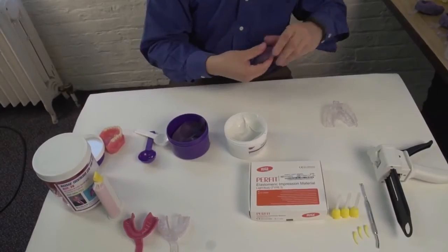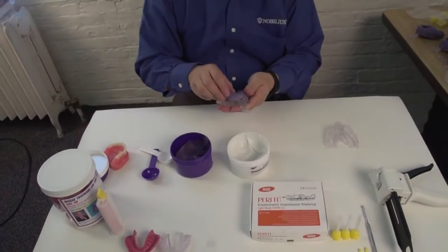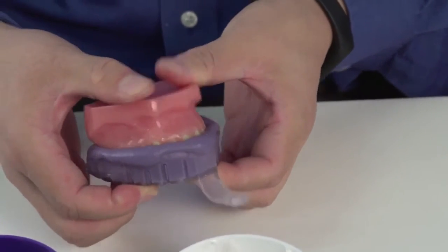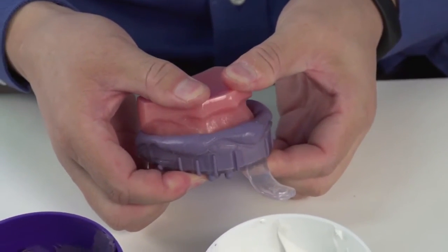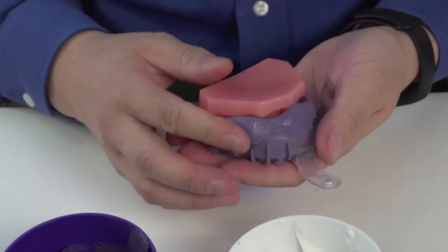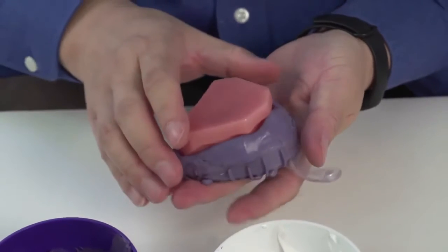Roll the putty into a cylinder and then insert it into the tray. And finally, insert the tray into the patient's mouth. Allow to set for 3 minutes. While waiting for the impression to set, press the material to feel the resiliency with your finger.